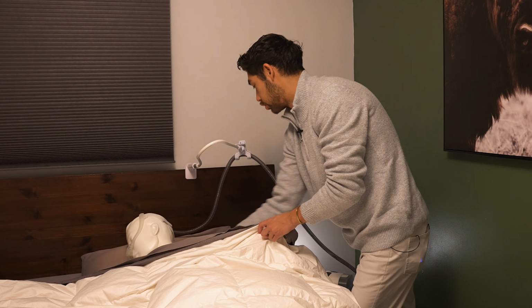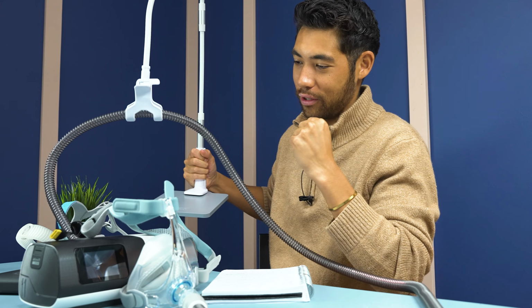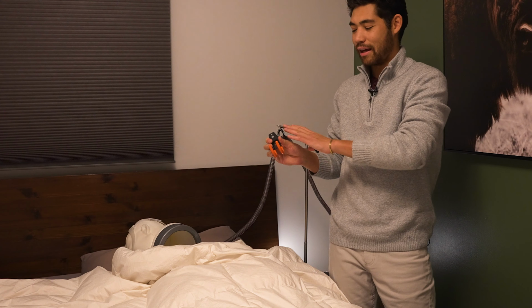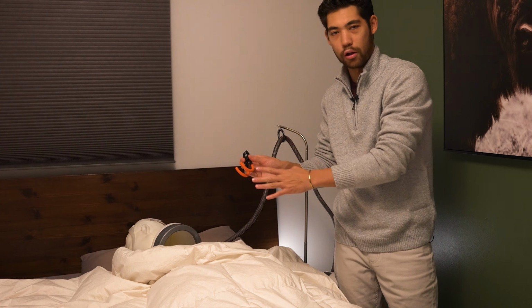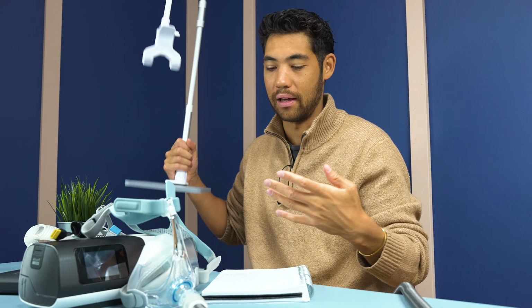But basically you put the tube in here and it's going to keep the weight of the tube off of your face. So you'll notice when you first start CPAP therapy, you're going to have a lot of tube drag, the tube getting caught in the pillow and stuff like that. It'll be rather annoying. A tube hook, or just any hook that you buy from a hardware store that you put on next to your bedstand, will work in keeping the tube a little out of your face and minimizing that tube drag.